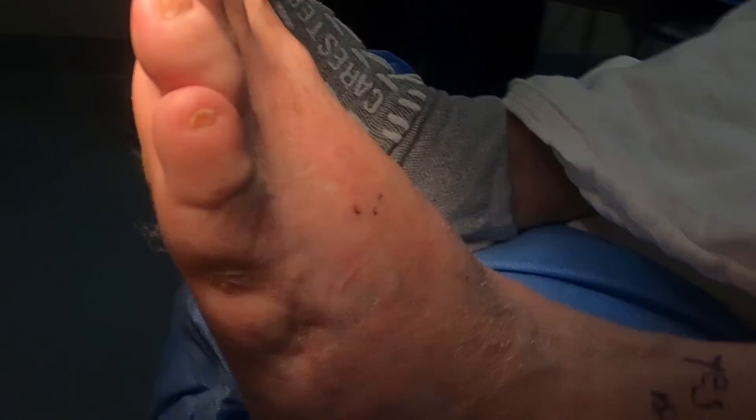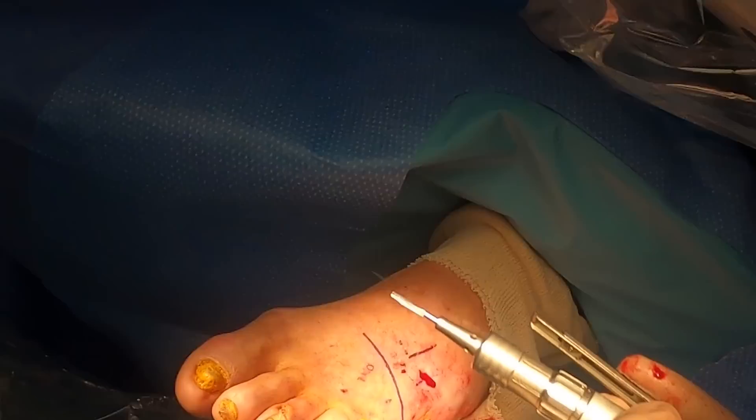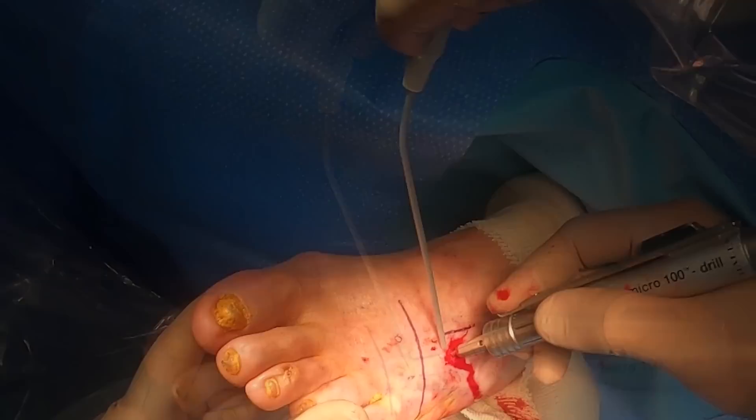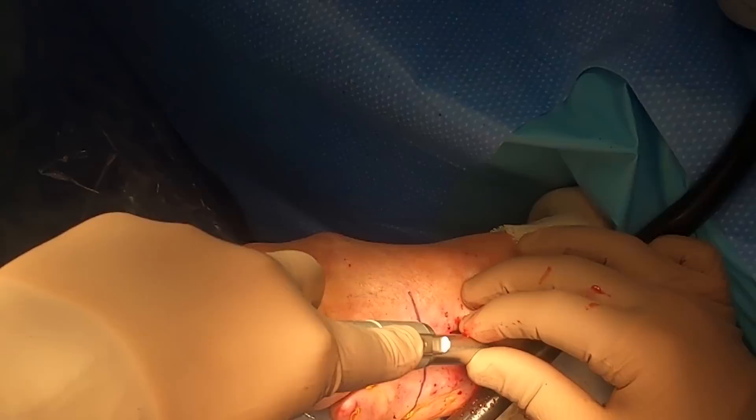My concern here is that he's got really thin skin, and so I decided to do this minimally invasively, utilizing fluoroscopy. I had to make a small hole on top of his foot to see if we can go ahead and cut the bone — the metatarsal bone — further back and essentially pull it through the wound. I was afraid that he might have some bone infection, so we were definitely wanting to send this bone off to be evaluated for bone infection.